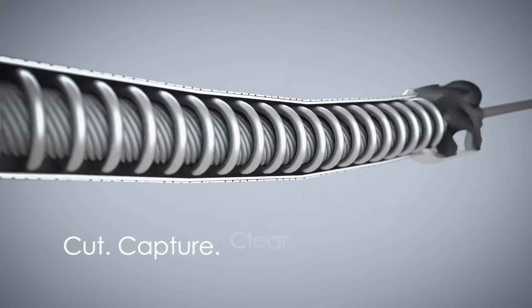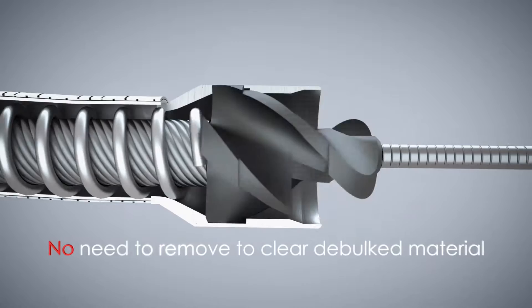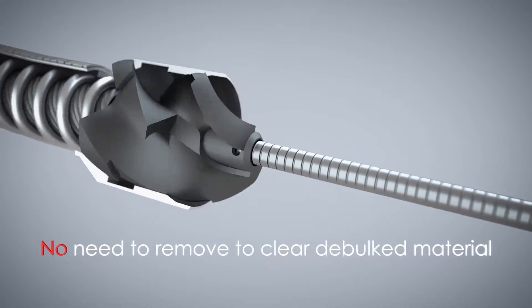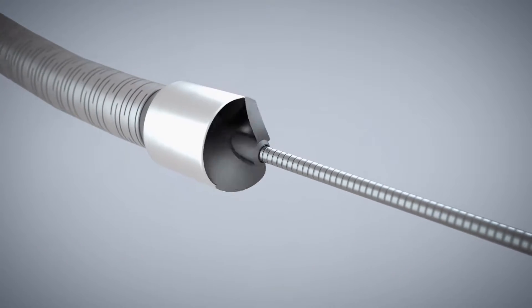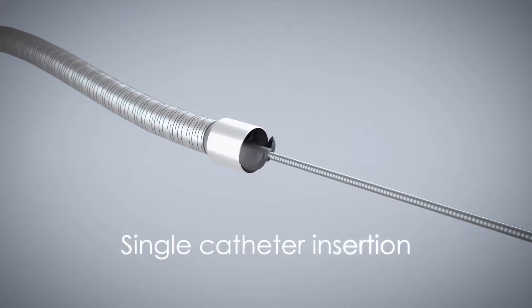This cut, capture, and clear mechanism of action eliminates the need to remove the catheter during the procedure to clean out debulked material from a nose cone. This allows physicians to debulk lesions of varying lengths with just a single catheter insertion.